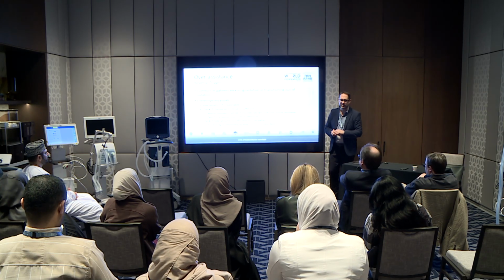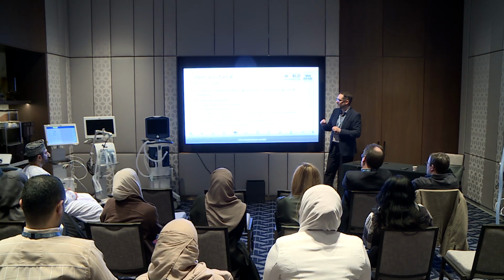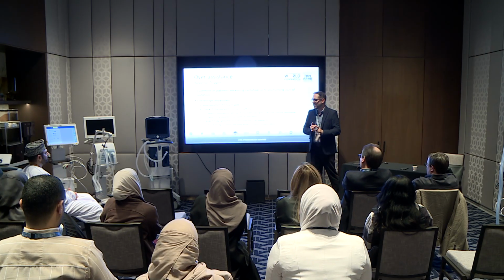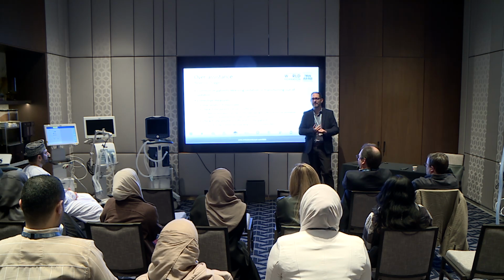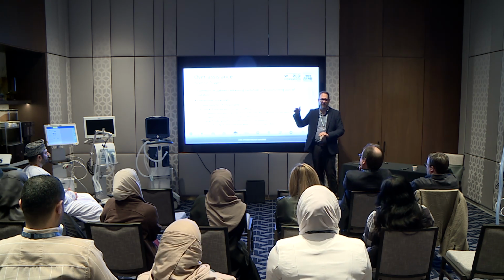It's common in patients that are sedated or transitioning out of sedation. So corrective measures: stop sedation if you can. Check if the patient's drive is sufficient. I can't tell you how many patients I saw reverse triggering. All I had to do was reduce the respiratory rate and the patient took over.